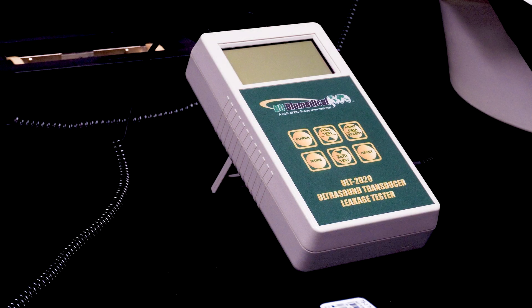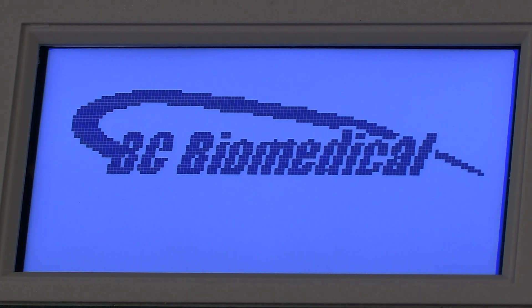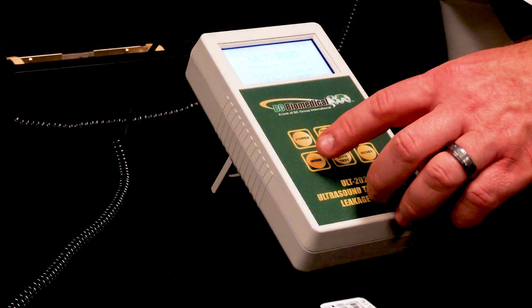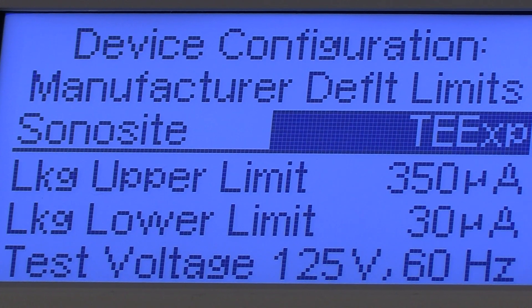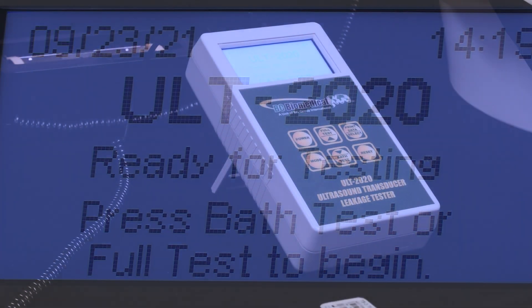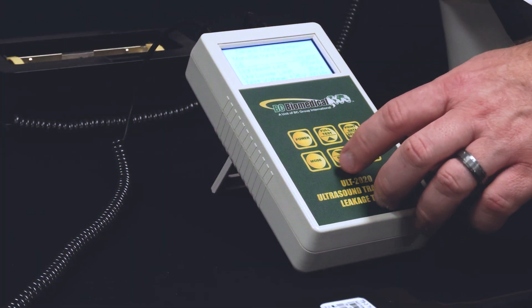Step 4: Turn on the ULT-2020 and run the test. Press the button marked power on the ULT-2020. The screen should light up. If not, verify the tester has fresh batteries or is powered by an AC adapter. Next verify the ultrasound leakage tester is set to test the correct ultrasound probe on the device configuration screen. The device configuration screen appears briefly as the ultrasound leakage tester is powered on and can also be viewed by pressing the mode button three times.